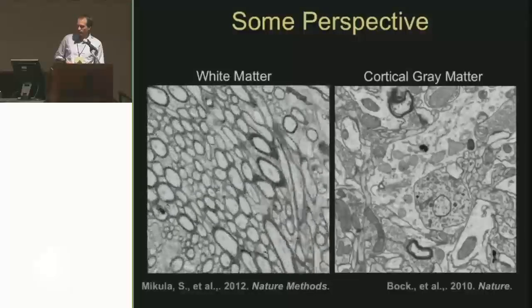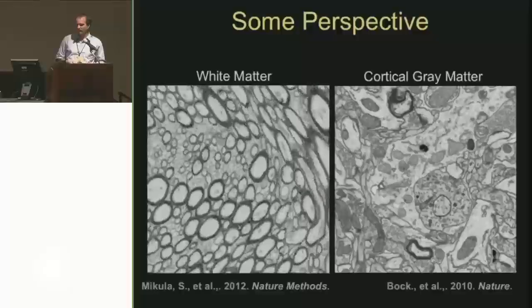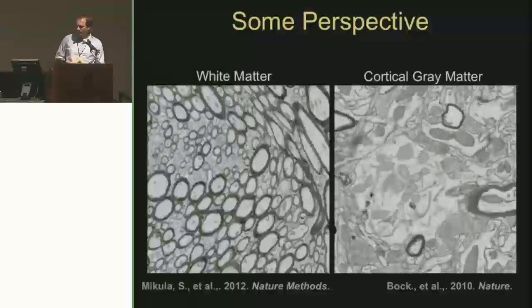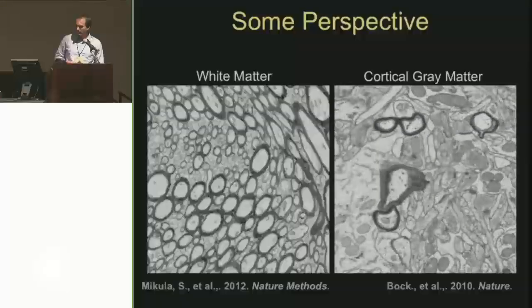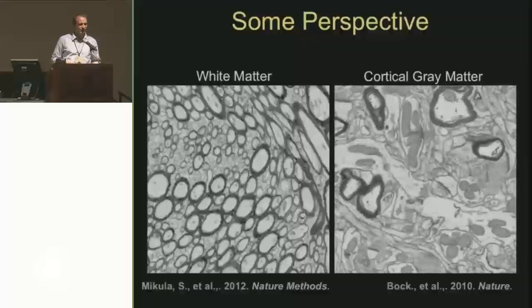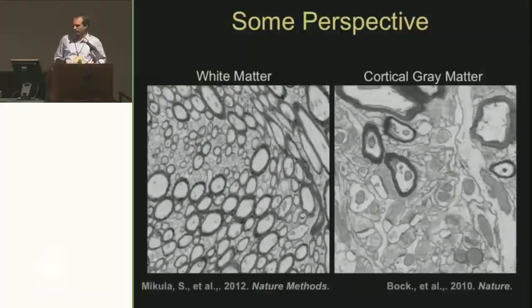It's quite revealing, and so again, just stepping back and trying to capture all of this, we're not really able to with current technologies. And if you think that's a problem, look at the cortical gray matter here. It's just, again, pretty astounding at the amount of complexity here. So in any diffusion technique, whether it be DTI or some other complex model, we're really getting a composite average in the voxel of what's going on, even if we're looking at multiple fibers or multiple different tissues.